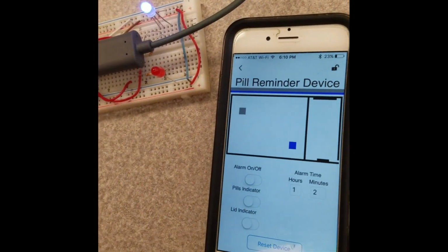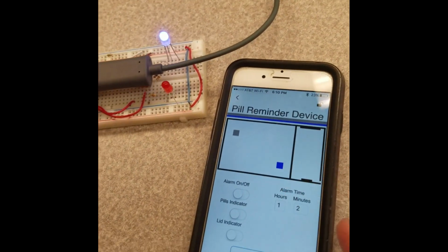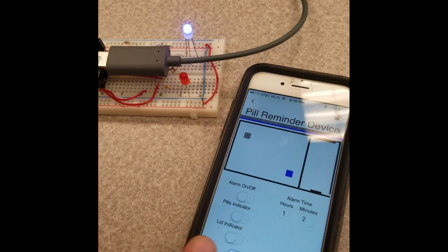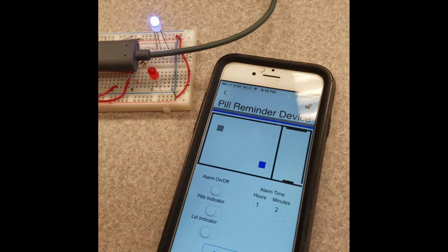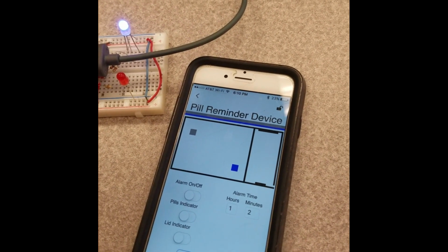But as you know, we ran into some issues with assembly as far as limitations that involved the hardware and the app. So we went down and simplified the system to have the user input switches for the different states rather than using hardware such as the IR emitter and detector for the pill's presence.